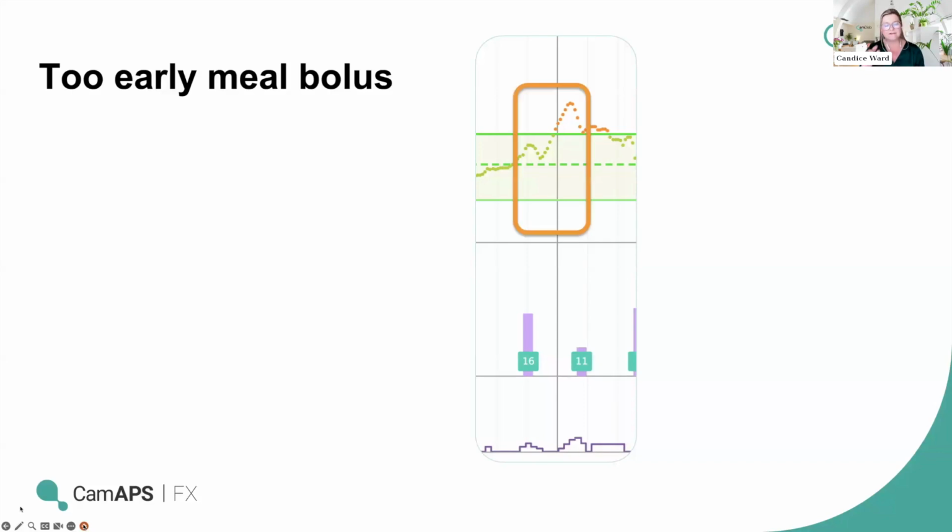So if you're seeing these V's, where the bolus goes in and then there's a drop in glucose before the rise happens, that might indicate that the bolus is being given too early. The insulin is already starting to act on glucose levels before the impact of that meal. And so the algorithm sees this drop. If you look at the bottom line, you can see in the purple, as soon as glucose starts dropping, the algorithm pulls back to stop the hypo, but it's then not there to support that postprandial period. And so you still end up high, which the algorithm then has to catch.